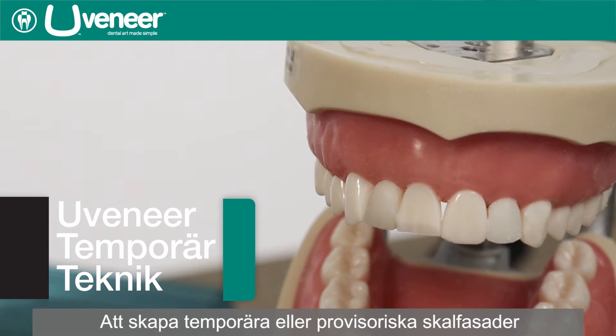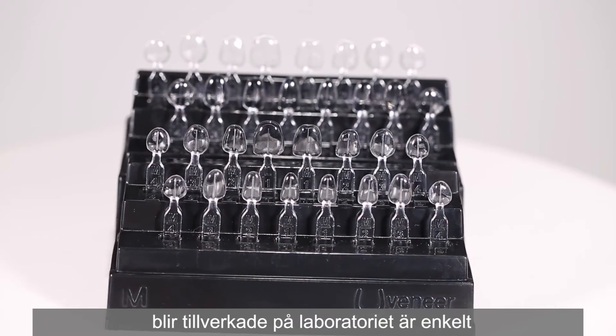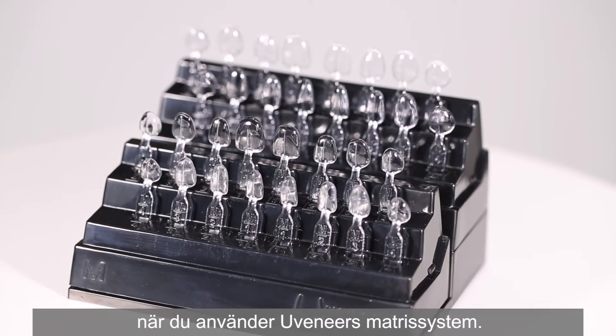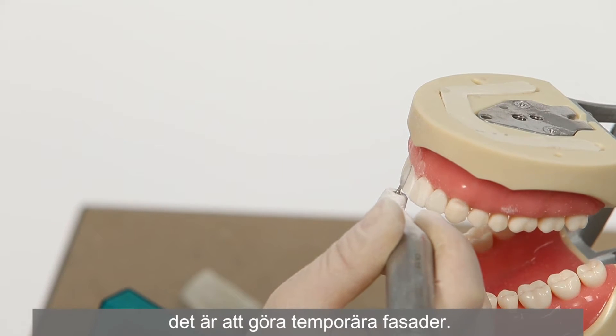Creating temporary or provisional veneers directly on the patient while their porcelain veneers are being made in the lab can be easily achieved when using the Uveneer template system. This video will demonstrate how easily temporaries can be made.